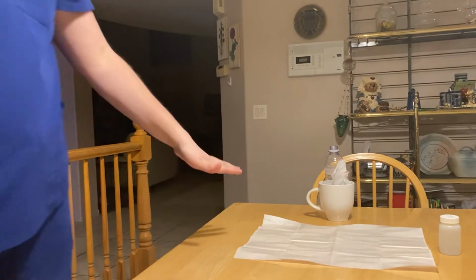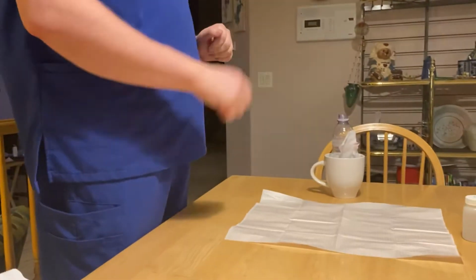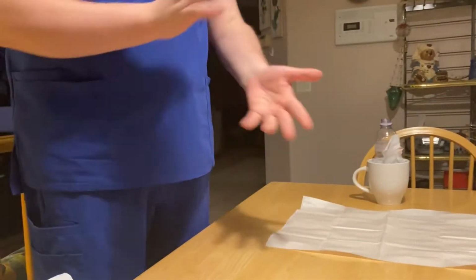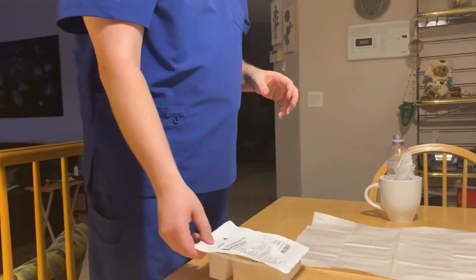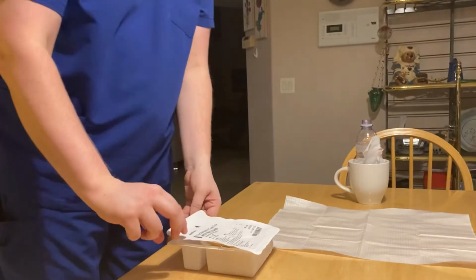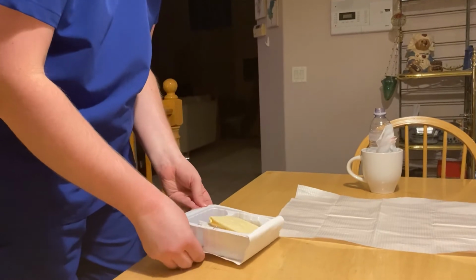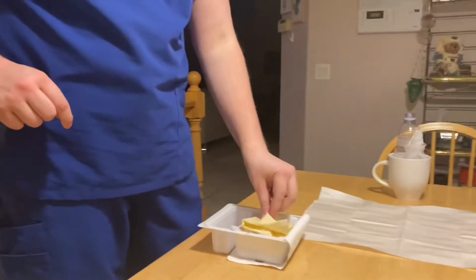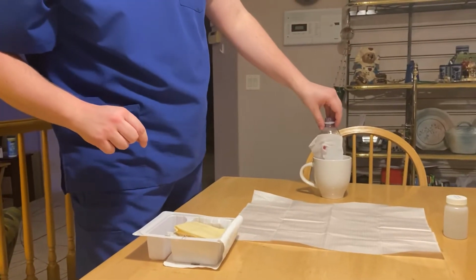Okay, so I'd leave the drape there because I'm now going to move on to my tracheostomy cleaning. So the first thing I would do, after I've cleaned up everything, I would do hand hygiene. Then I'd get my tracheostomy care kit, just in case, perform hand hygiene again. Open the care kit away from myself. And then I'm going to fix my patient real quick so it's facing us.